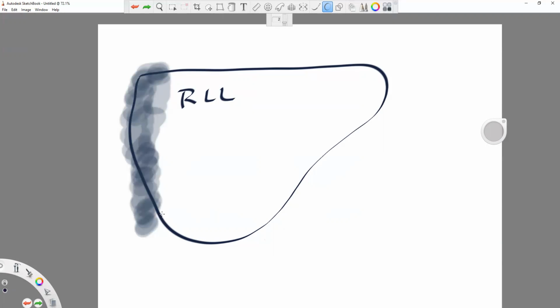So what we've done traditionally is measure from here, the last part of the liver you can see, to the last part of the liver you can see at this end. And that's all well and good, but it's actually technically incorrect. This is what everyone's been doing.